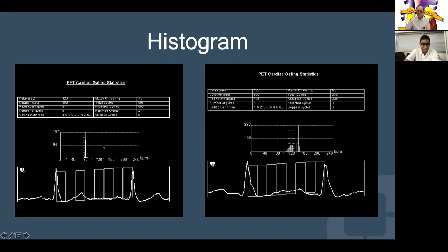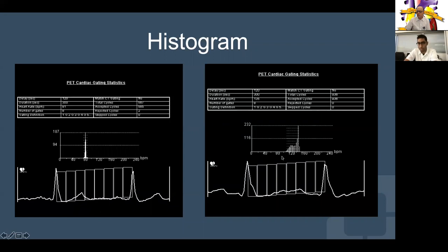The stress histogram shows heart rate was relatively stable at 80 bpm at rest. The stress histogram is spread from 120 up to 150, partly because the patient was having frequent PVCs causing this widening. This is a QA step to check in every test — if you see an unusual ejection fraction, the machine may be double-counting QRS and T waves, or the patient may have gone into AFib, compromising the reliability of the EF.